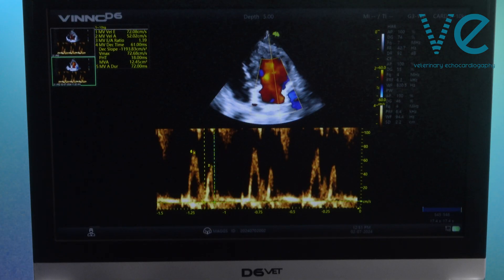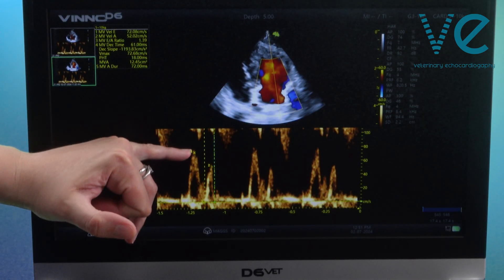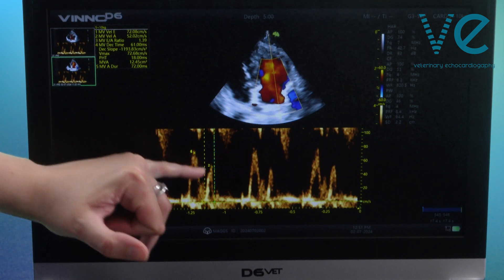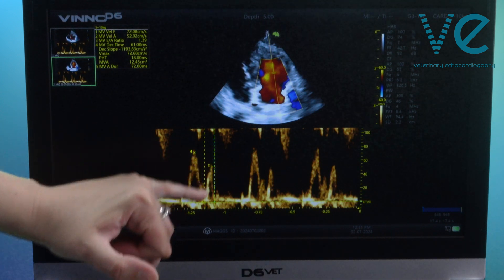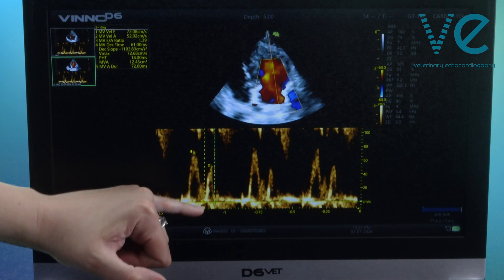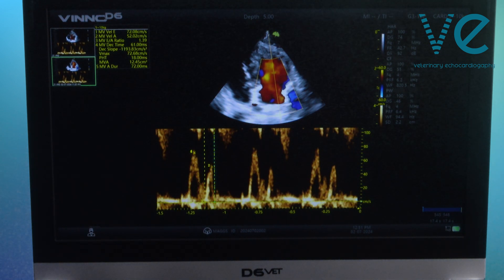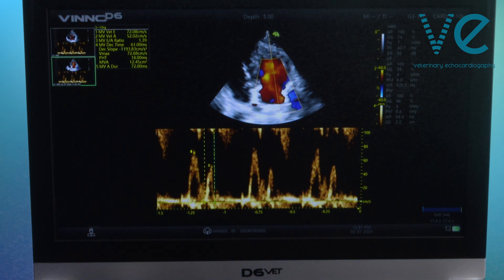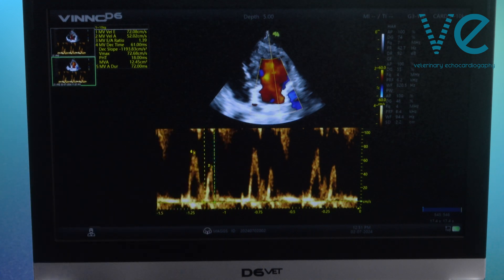The measurements I have taken here are the peak E wave velocity, the peak A wave velocity, the duration of the A wave, and the deceleration slope of the E wave. But all you really need to do in a basic assessment of diastolic function is get your peak E and A waves.